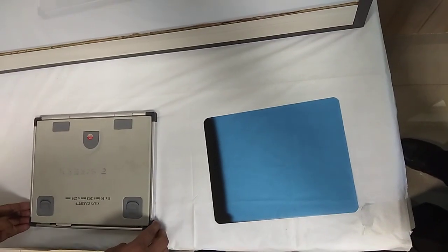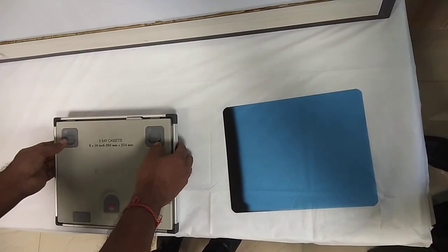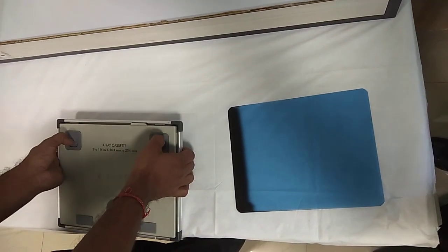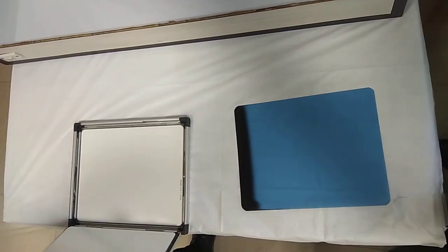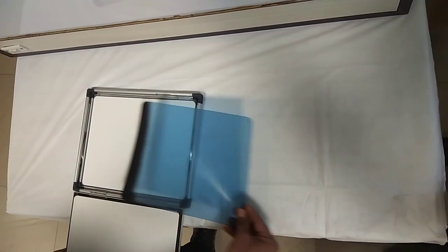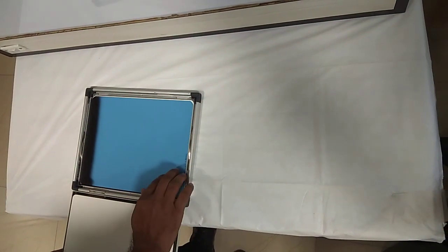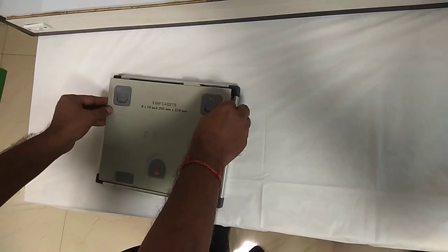To load a cassette, first make it so that you can pull the locks and it opens. Now that it has opened, place the film in the cassette, then close it by pressing it from the sides.